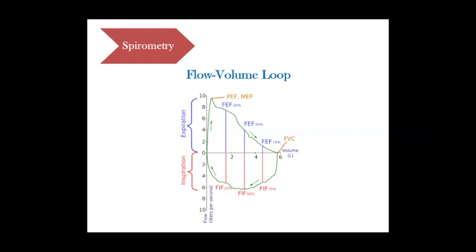On the inspiratory part, we can obtain similar parameters, which means forced inspiratory flows and peak inspiratory flow, and more other parameters.